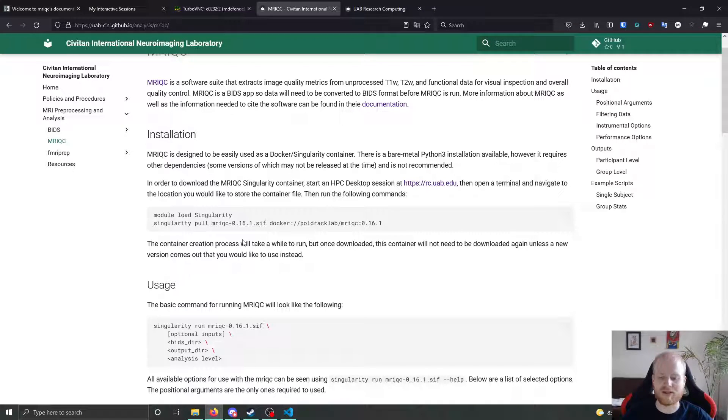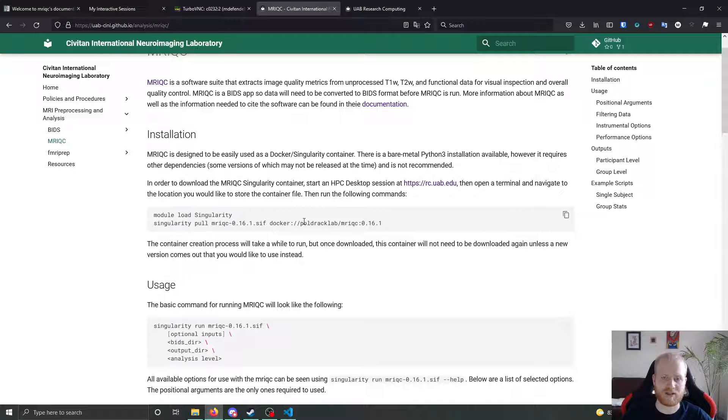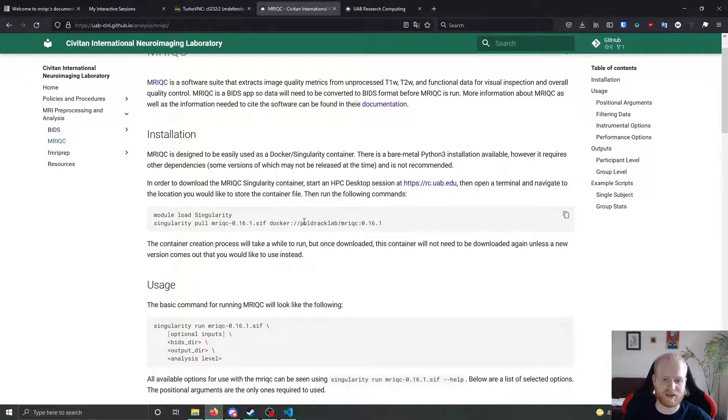So this process will take a while to run. But once it's run and finished, you don't need to download the image ever again. It'll just be there for you to use whenever you need it. So you can put it in your project space in your labs project space, and everybody will have access to it.